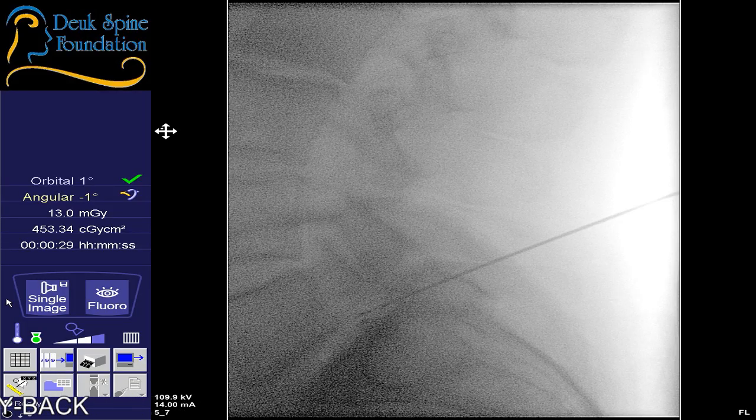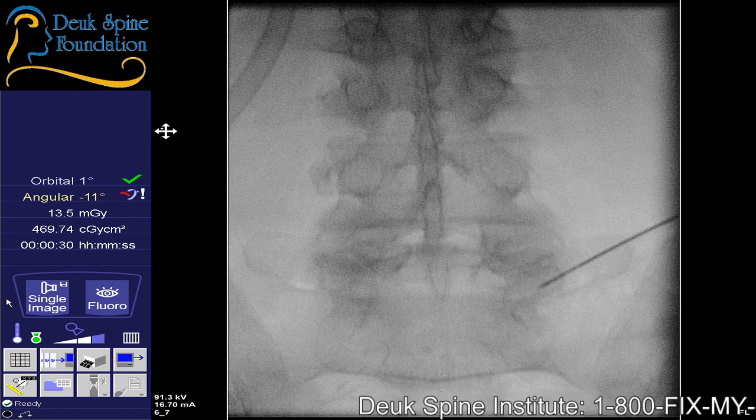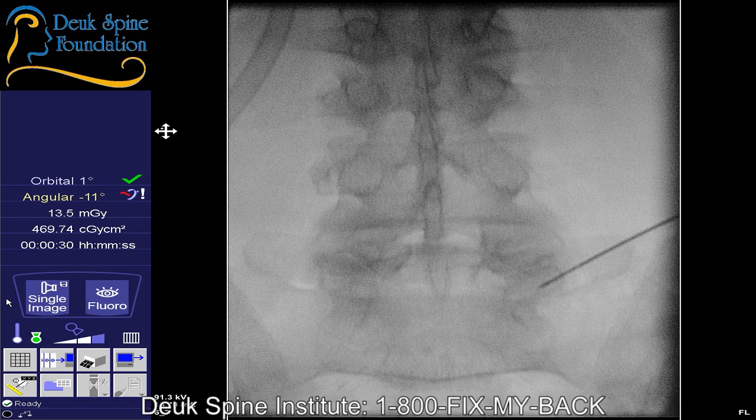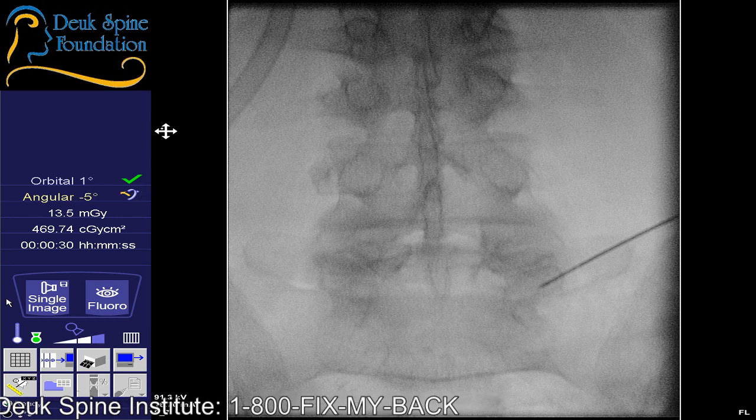But the angle is actually, in a way, favorable because it makes me go more north, up towards your head, more rostrally, which is better than having to go caudal. All right, so we're almost at the mid-pedicular line, which is good. Back to a lateral, please. Pretty much at the mid-pedicular line, which is good.